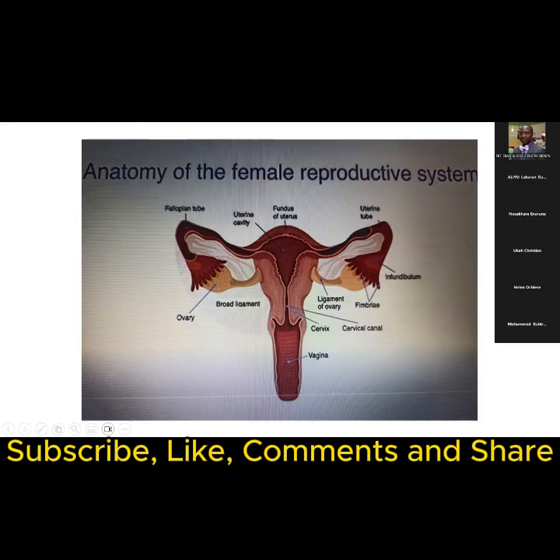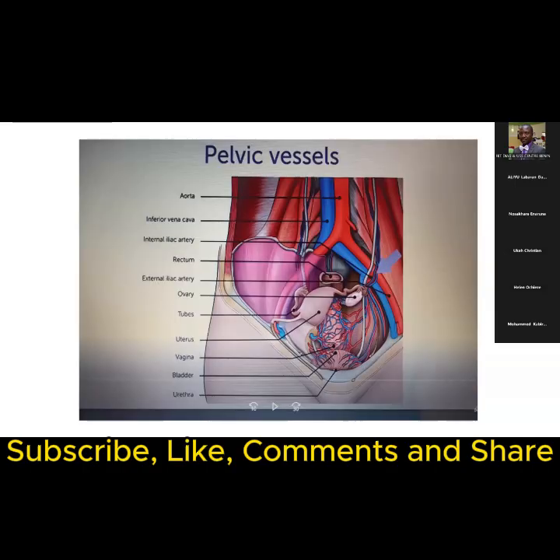Despite the attachment that the ovary has to the uterus, and to the pelvic sidewall through the infundibulopelvic ligament, and even the broad ligament, it is quite a very mobile organ. And sometimes it can be very challenging determining the location of the ovary during a scan examination. Something that helps, perhaps, is what I will talk to you about in this image of the pelvic vessels.